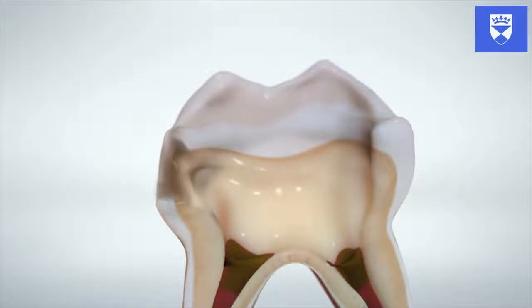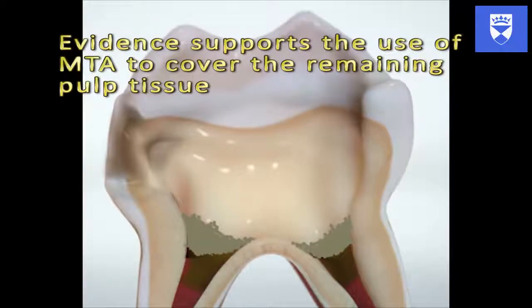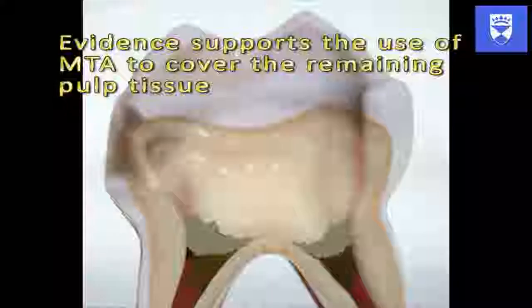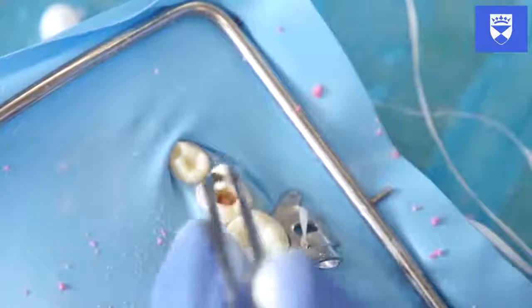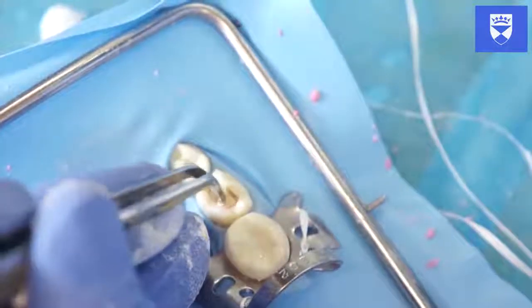Gently remove the cotton pellets and observe hemostasis. Fill the pulp chamber with a zinc oxide eugenol material. Use a flat plastic and a plugger for packing this.